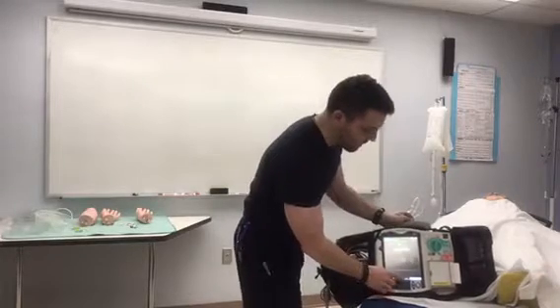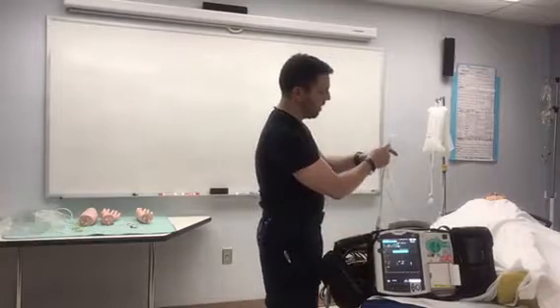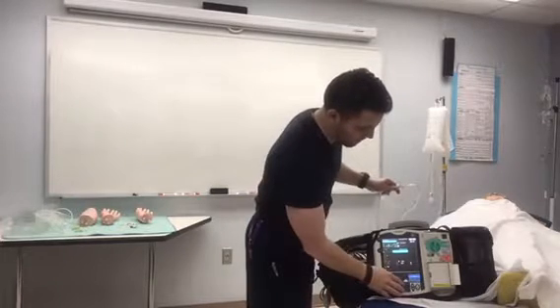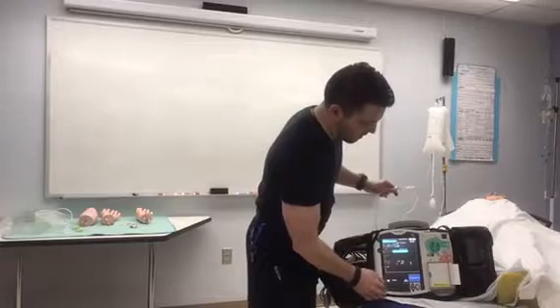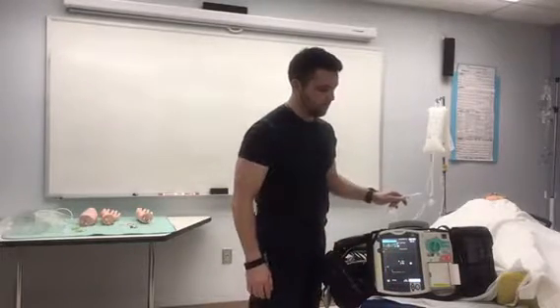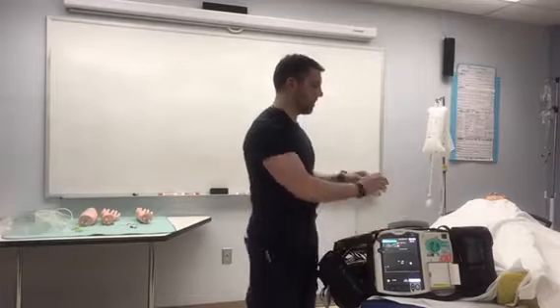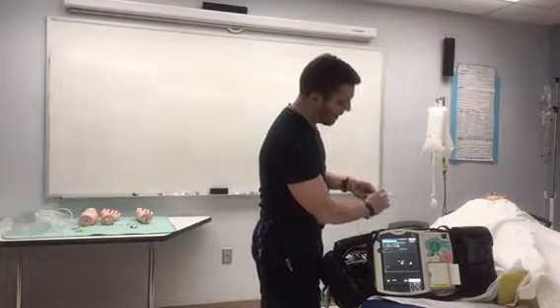So what we're going to do is this button here says zero pressure. We turn our three-way stopcock off to the patient, and we zero our pressure. So we're currently on our PAP, so we're zeroing our PAP, yes. And now it says PAP zeroed, and it gives us a timestamp. All right, so once it's zeroed, we can now proceed on to the fast flush test.